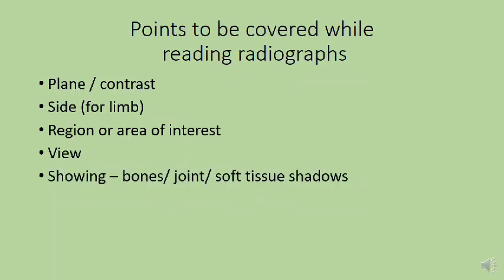Finally, you should conclude by saying what it is showing, what bones are shown, which joints are exposed in the field, and you should not forget to mention the soft tissues around as well. So these are the protocols which have to be covered while reading radiographs of limbs.